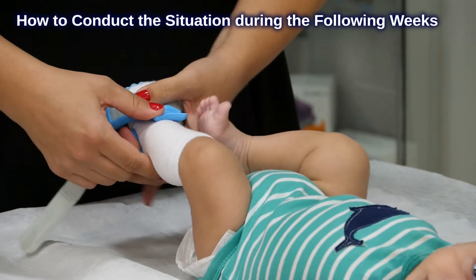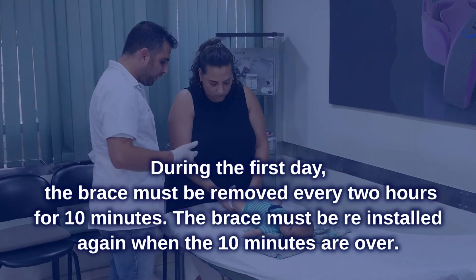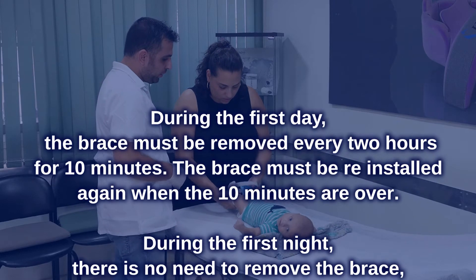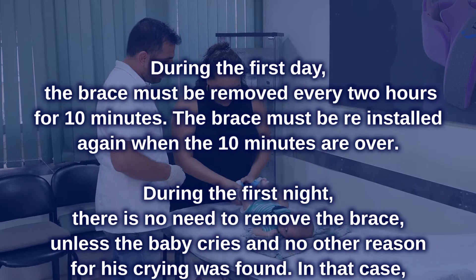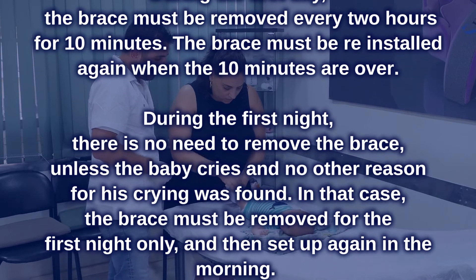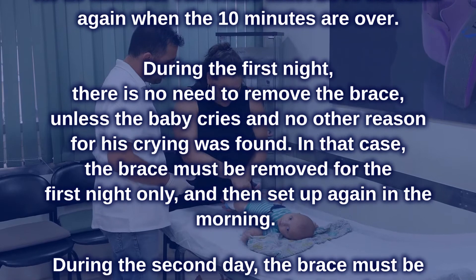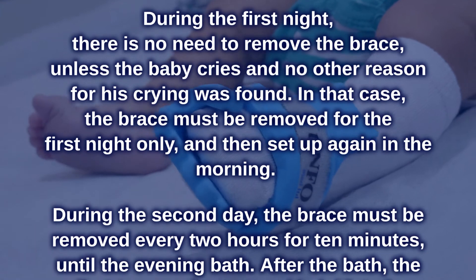Explain to the parents how to conduct the situation during the following weeks. During the first day, the brace must be removed every 2 hours for 10 minutes, then reinstalled when the 10 minutes are over. During the first night, there is no need to remove the brace unless the baby cries and no other reason for crying was found. In that case, the brace must be removed for the first night only and then set up again in the morning.